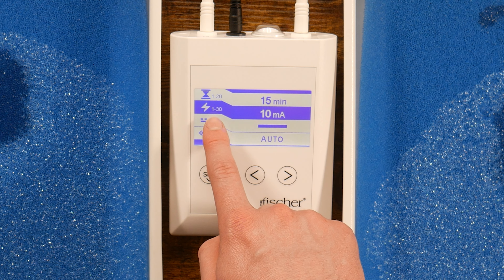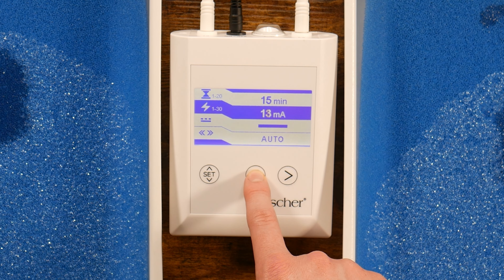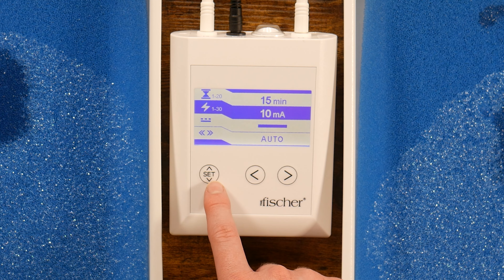To adjust the strength of the current, press the left and right arrows. The treatments start as low as 1 milliamp up to 30 milliamps. After selecting your current strength, press the Set button again.